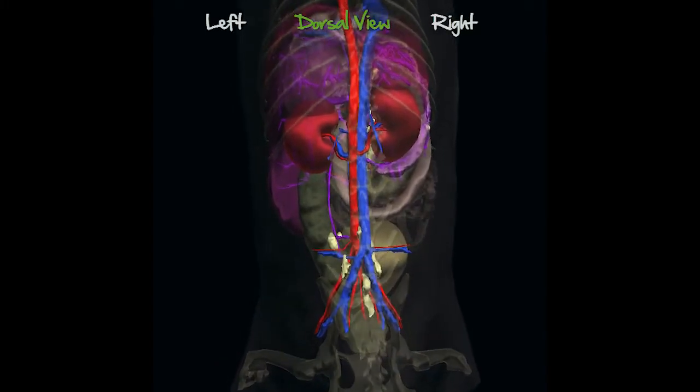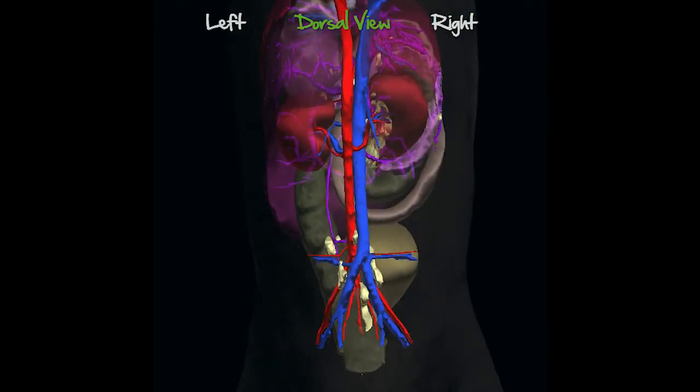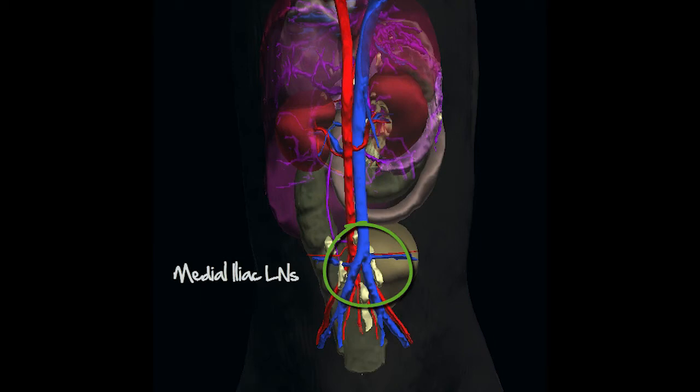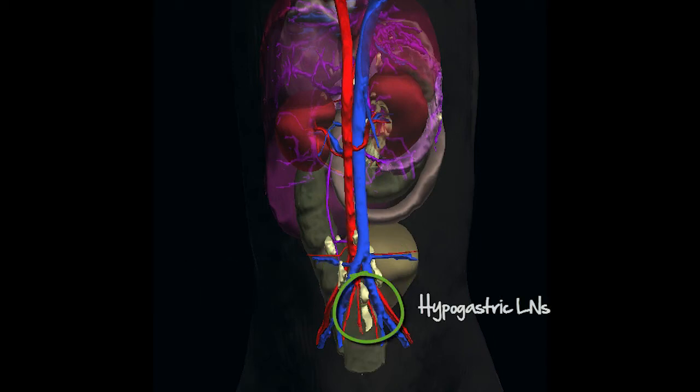In the dorsal view, we can first see one of the main groups of lymph nodes, the sublumbar nodes, at the caudal end of the aorta and caudal vena cava, at the site of bifurcation of iliac vessels. The medial iliac lymph nodes are the largest and normally visible in most dogs, whereas the hypogastric nodes are more caudal and central and more difficult to identify unless enlarged.